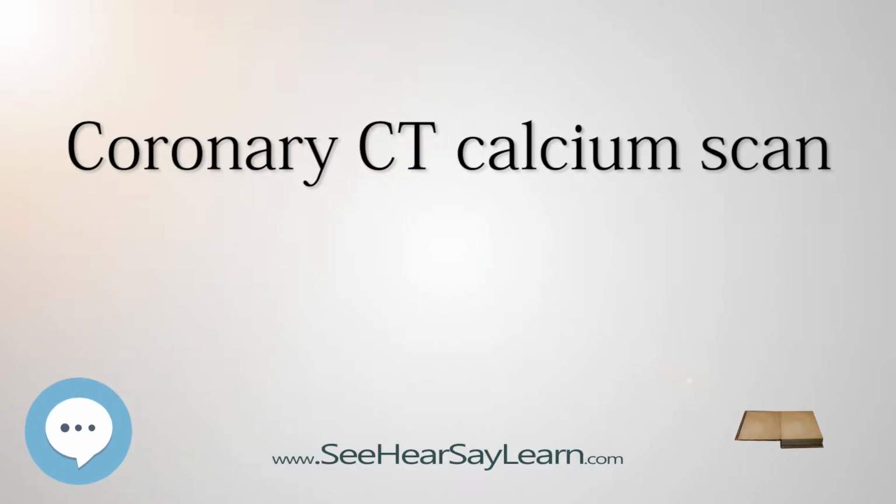A coronary CT calcium scan is a computed tomography (CT) scan of the heart for the assessment of severity of coronary artery disease. Specifically, it looks for calcium deposits in the coronary arteries that can narrow arteries and increase the risk of heart attack. This severity can be presented as Agatston score or Coronary Artery Calcium (CAC) score. The CAC score is an independent marker of risk for cardiac events, cardiac mortality, and all-cause mortality.